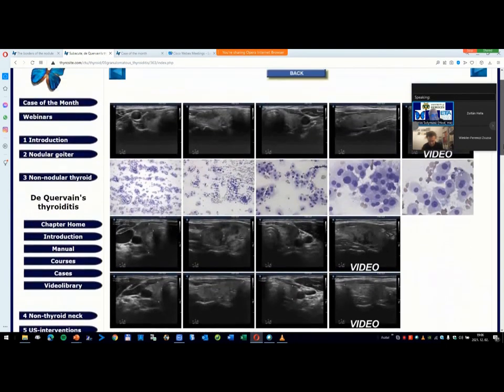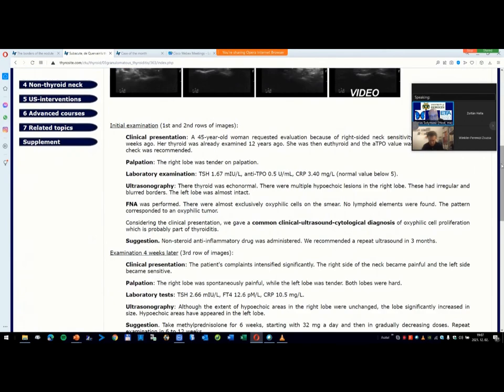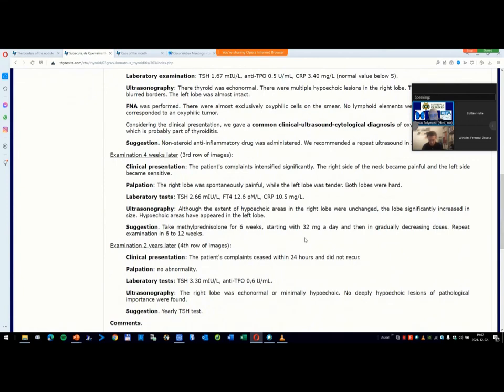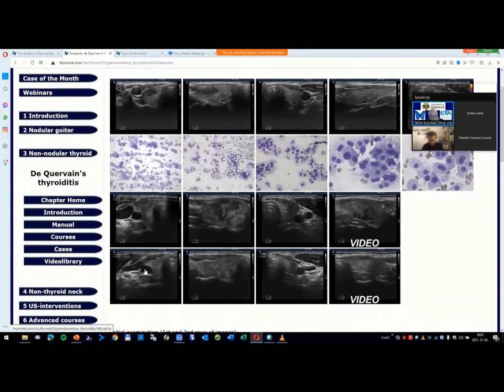Four weeks later, these are the images which were recorded. The extent of the hypoechoic areas increased in the right lobe and similar hypoechoic lesions appeared in the left one. The difference between these images is four weeks. And the last image was recorded two years later — you can see that the right lobe is almost intact, and the degree of hypoechogenicity has significantly decreased even in the left lobe.